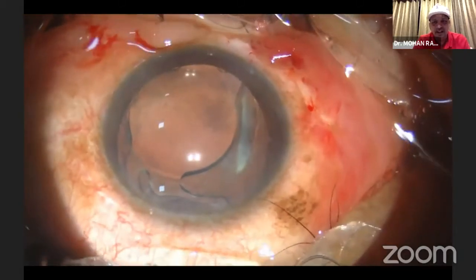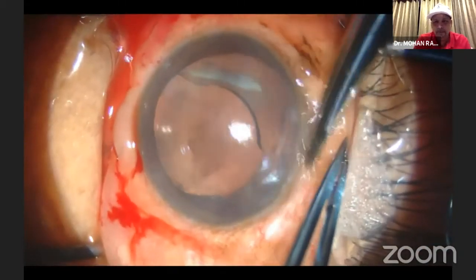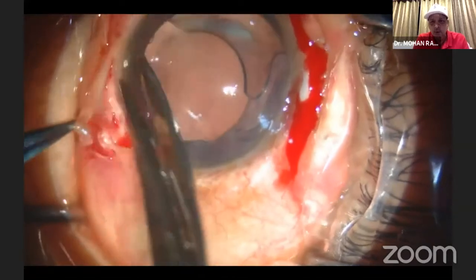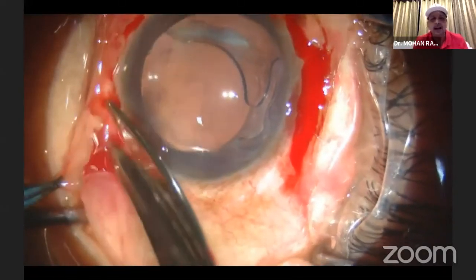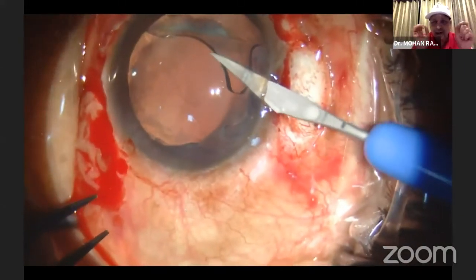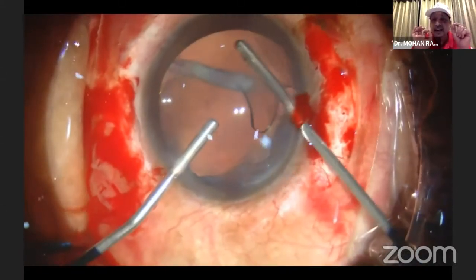That is what I'm going to show you. This patient is one of my golf caddies, an alcoholic who got bashed by his wife and subluxated. I thought, let me be heroic and try to open up the conjunctiva — everybody is talking about Gore-Tex. Why am I not doing Gore-Tex? I'll do the Gore-Tex suturing and try to fix this single-piece hydrophilic lens. This is the Rayner-type lens. I found this lens a little tricky.